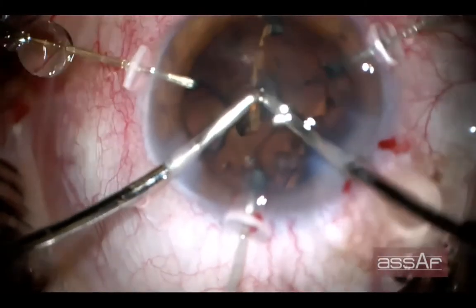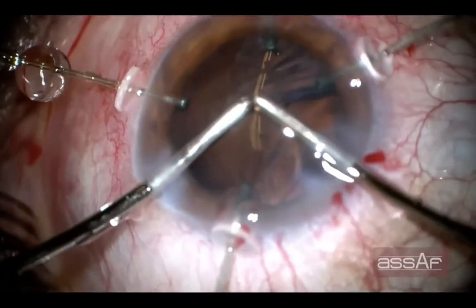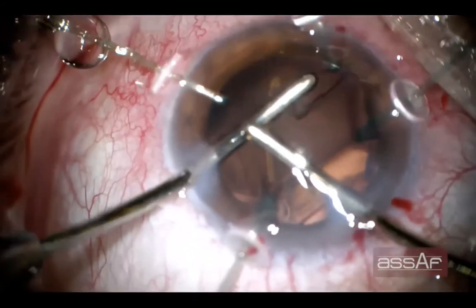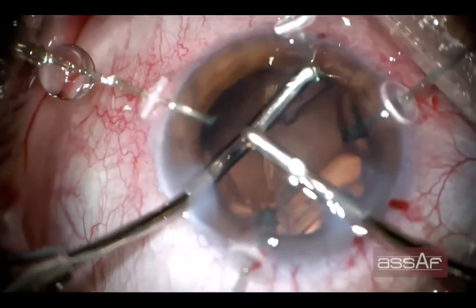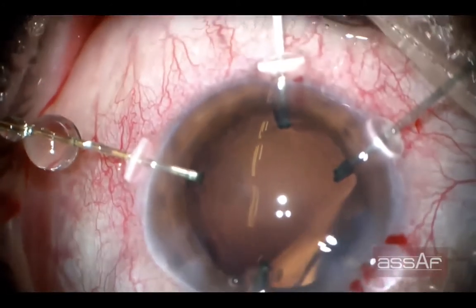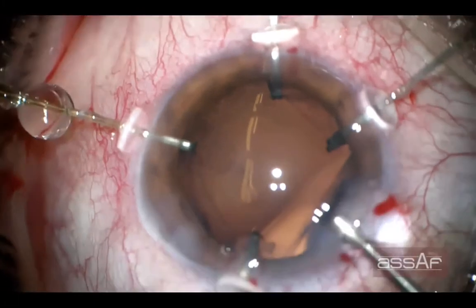We can continue to the next step, which is cortical cleanup by irrigation aspiration, and this is another merit of this capsular support system over the capsule tension ring, because the capsule tension ring sometimes makes the cortical cleanup more difficult by entrapment of the cortical fibers in the lens fornix, but the capsular hook system makes the cortical cleanup very routine, quite similar to a routine phacoemulsification case. So this is the best time to implant the capsule tension ring.